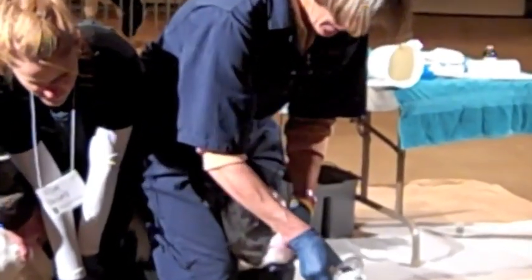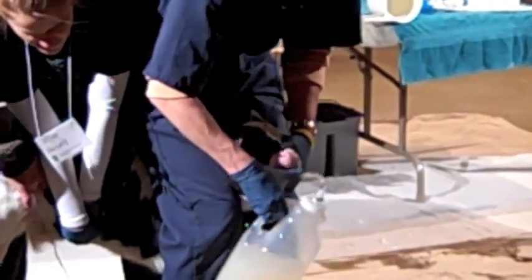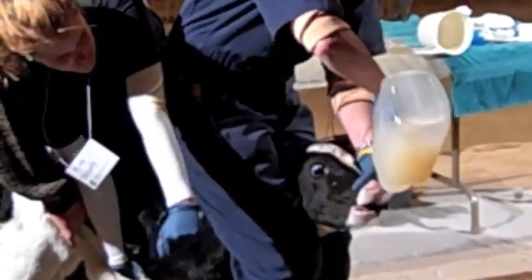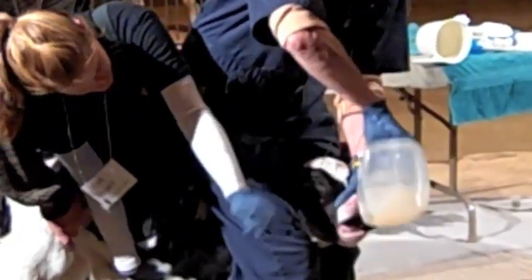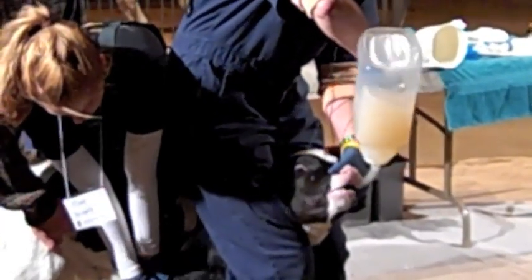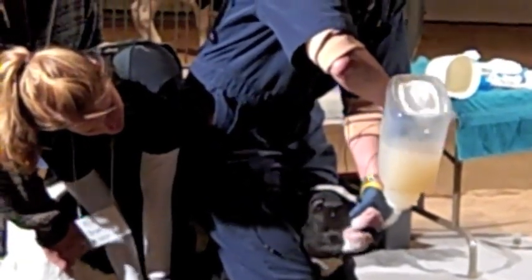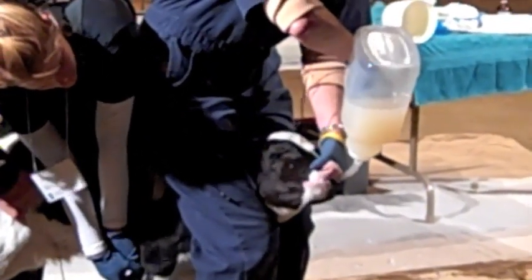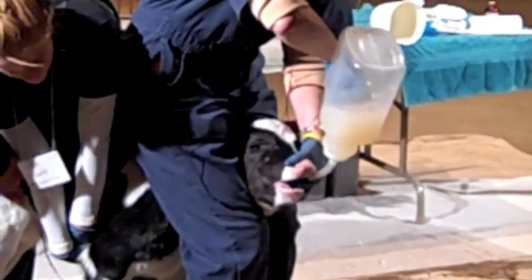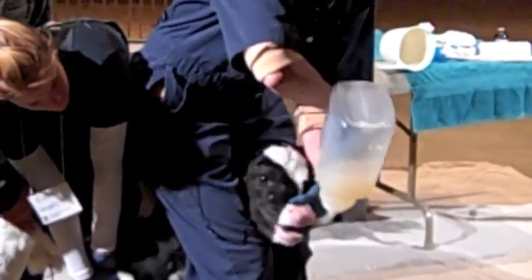Nose down. Left side of the mouth. Pass it. Once it swallows, the tube passes very easily, and I know when there's only four inches left. Now I'm going to hold on. Now the calf can change its head position — I'm okay. And then just gravity flow. If the calf fights and throws itself over, and you're giving four quarts of colostrum, there's no way somebody's going to pass it again. Take it out, refill it, and pass it again. Make sure you have the right tools for the right calves.